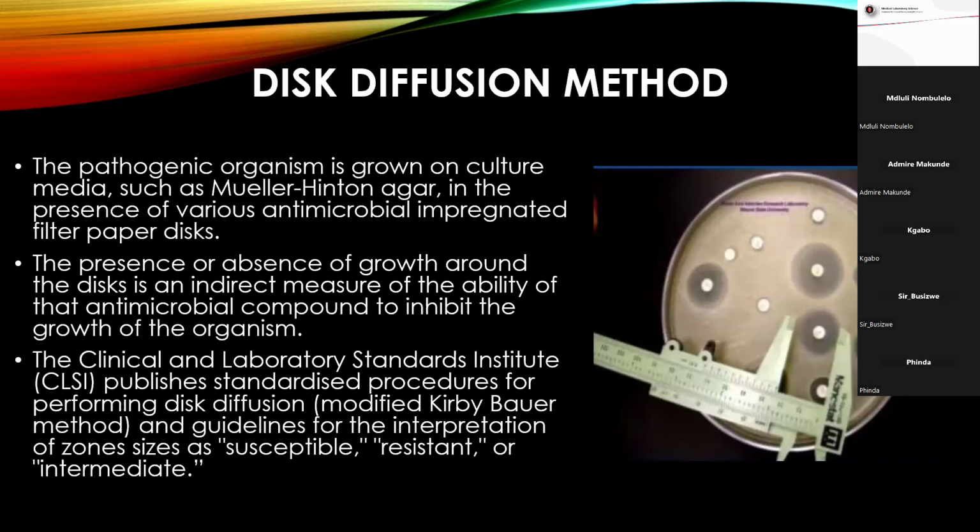So what you do, you prepare a suspension and streak it on the plate, then you put those discs, and you incubate over a period of like 24 hours, but it depends on certain antibiotics and certain organisms. I'm specific on that because for some antibiotics it's 18 hours. Those are standardized methods.